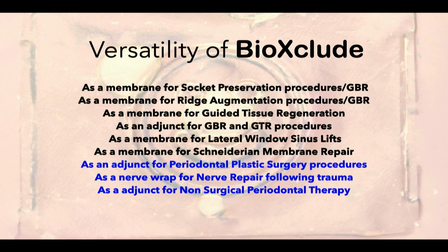Speaking of the defects of the extraction sites, I saw that you were tucking the membrane in just a little bit lightly, but you have a little bit more of an application to distance. Do you find that you're tucking that deeper?